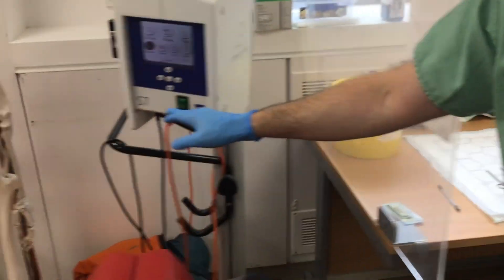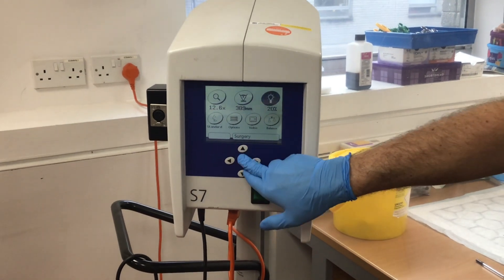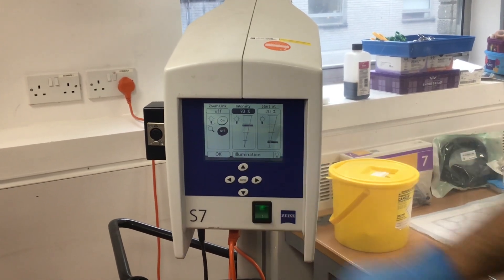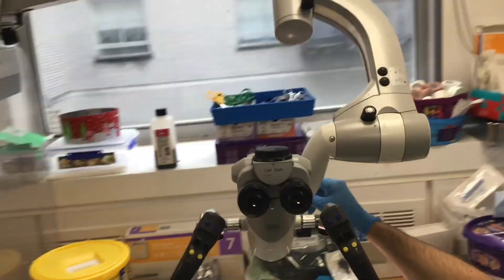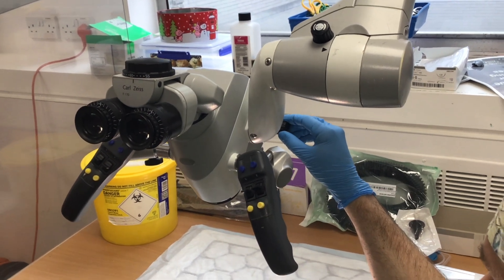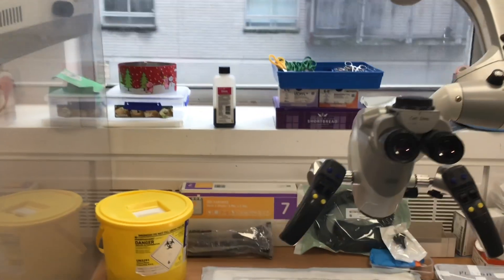The microscope is all warmed up now and you can change the intensity of the light. Press enter and then put it up to a nice bright field. You can also change the size of the brightness by adjusting the knob at the back. Probably the best thing is to have it nice and wide so that you get a nice field. That is, by and large, all set up.